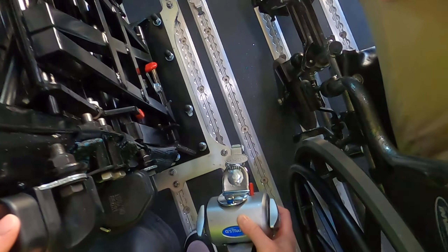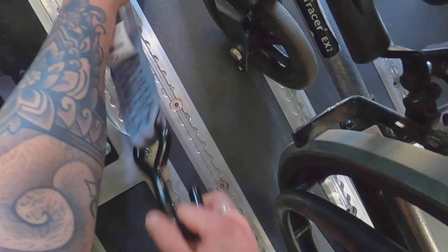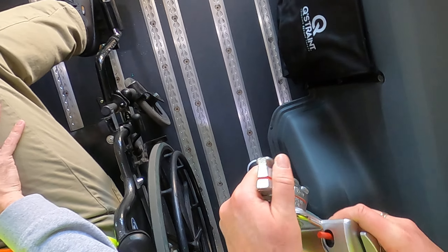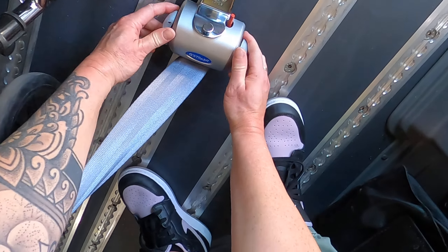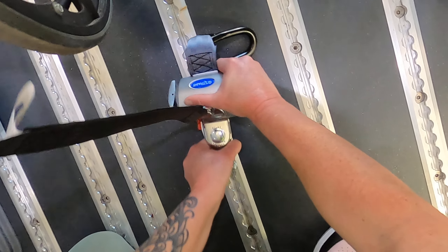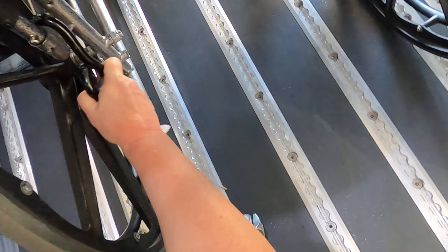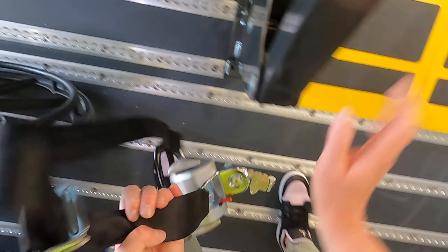The front securements go wider than the frame. I put the retractor in the track and attach the hook to a solid frame member using a direct path, then tighten it up. On the other side, I do the same thing — notice how I'm getting as close to the seat as possible, which will help prevent tip overs. Now on to the back securements. They will go narrow and inside the wheels. The angle is a little greater than 45 degrees because I need room for one more mobility device. If I was only transporting two, I could move the retractor back and give myself a better angle.